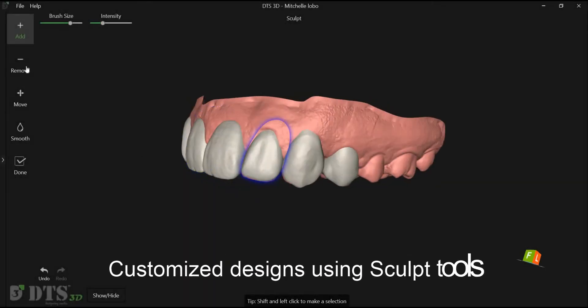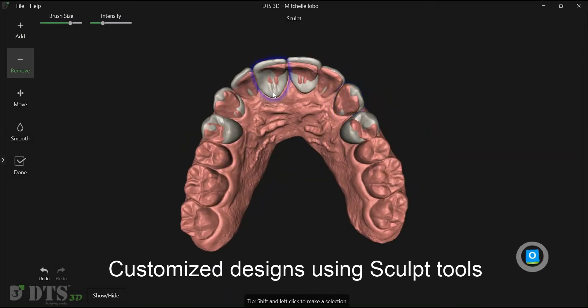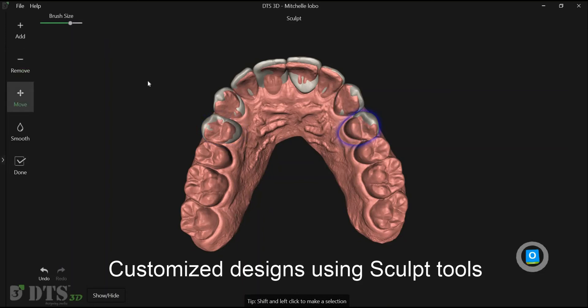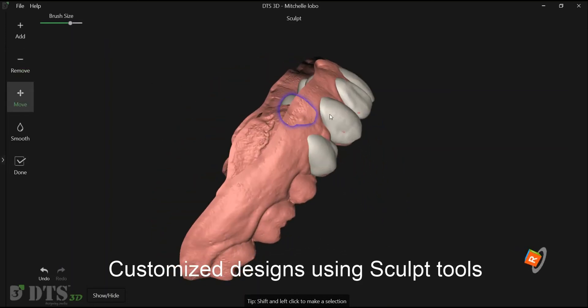The sculpt tools help in refining the designs. We can add, remove, move, or smoothen the textures.